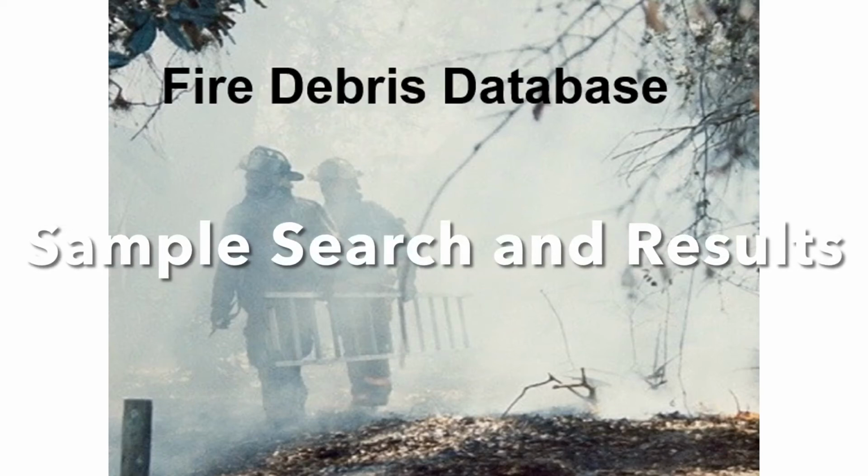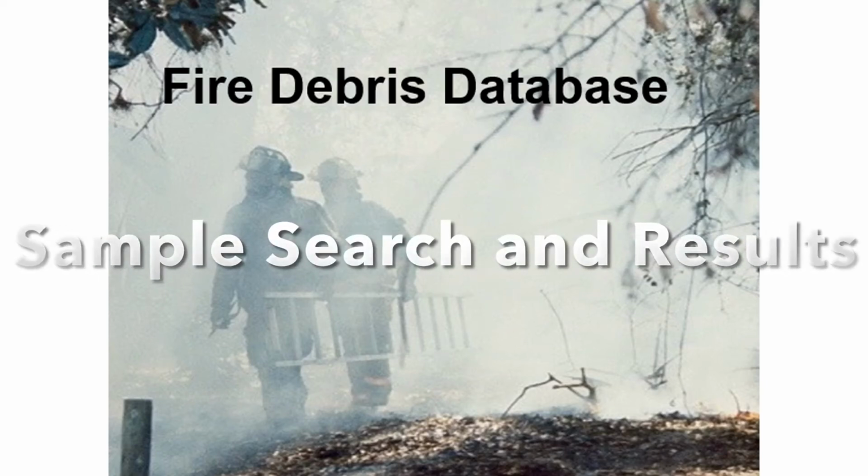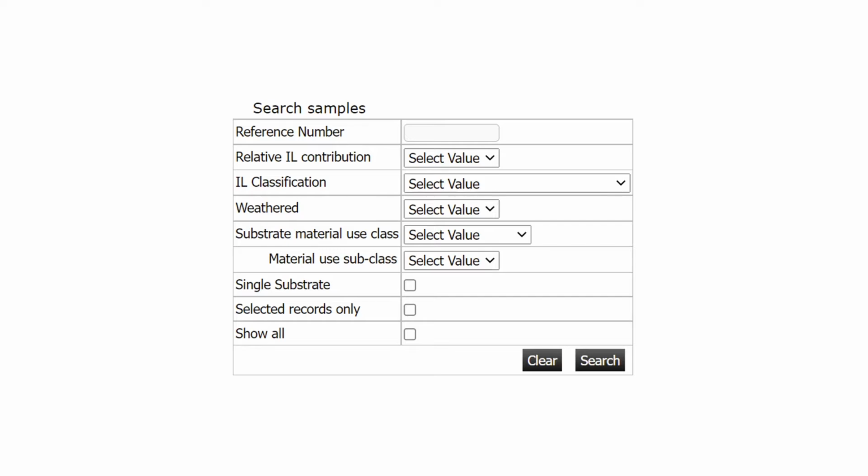Fire debris database, sample search and results. Search parameters include the reference number of the fire debris sample record, the relative ignitable liquid contribution, the ignitable liquid ASTM E1618 classification, the extent of weathering, and the material class and subclass of the substrates.